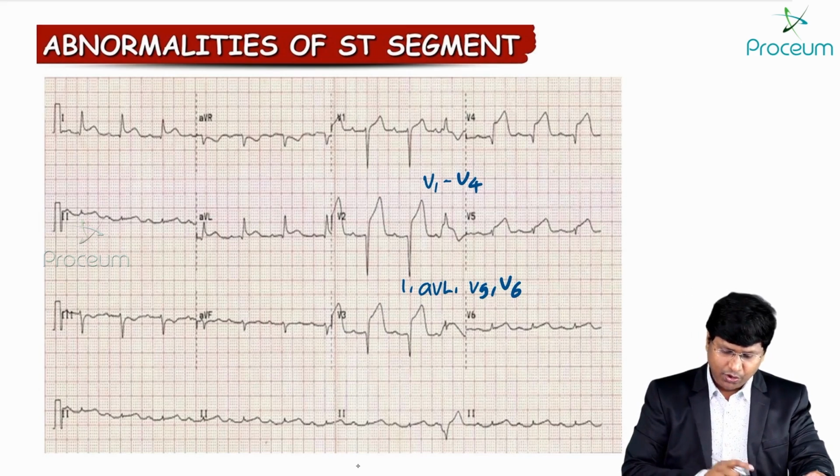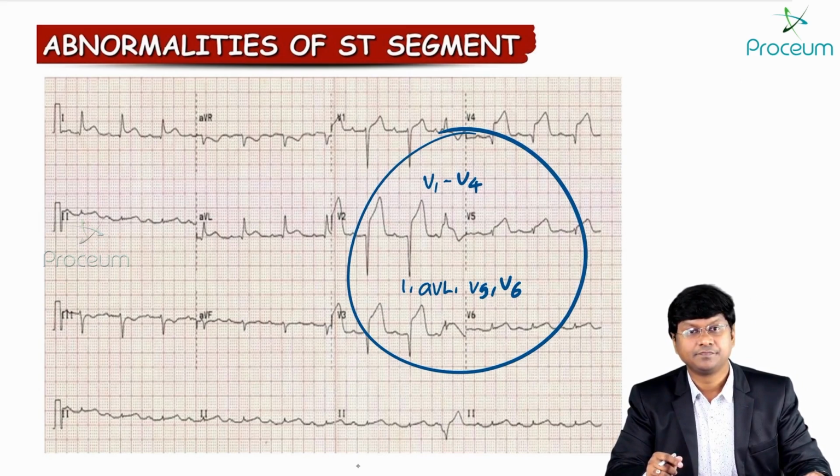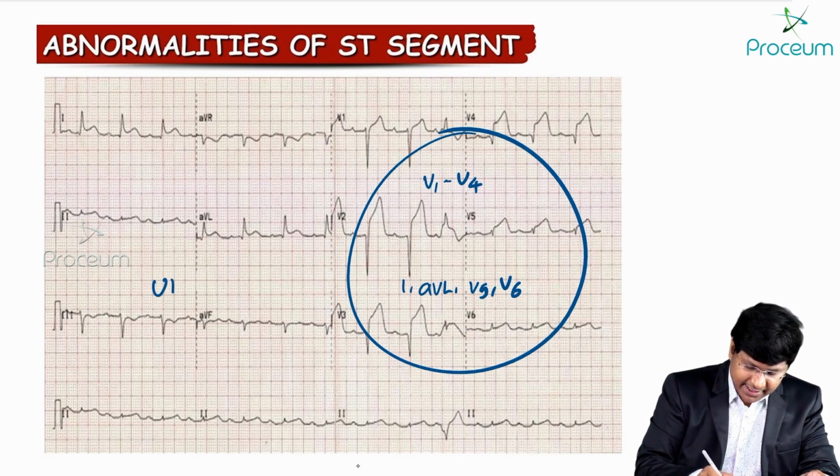Okay. So, the point here that you need to understand is, this is a patient with an acute anterolateral MI. This patient requires urgent reperfusion.